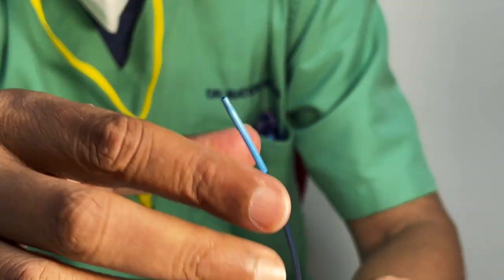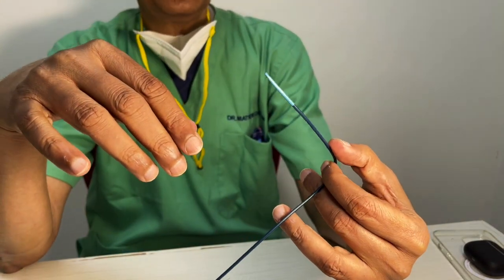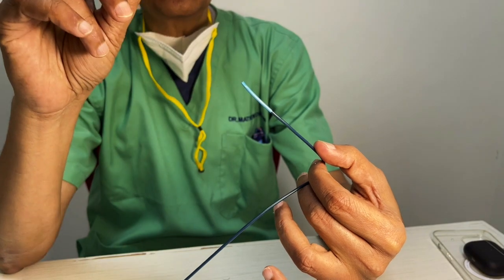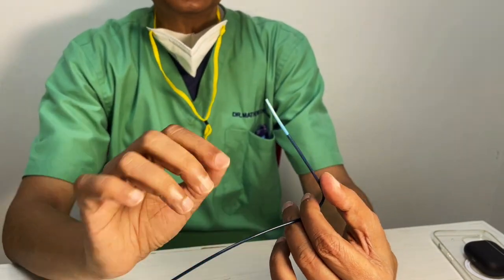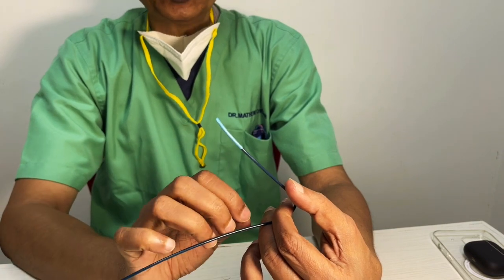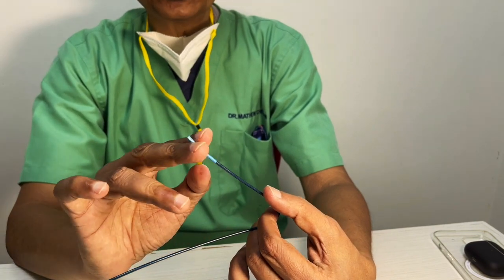So you can use this. It's pretty good because it's stiff. Now see what happens. You have this catheter like this across the arch and into the left carotid artery. Now when you push, devices will go distally through it and it will not push this device because this is kept fixed. You don't move it once you've got into a secure position, and that is why for any neuro procedure where you cannot have the neck in view all the time, it is better to have a long sheath. So today we would use that.